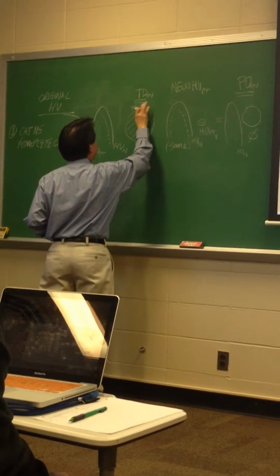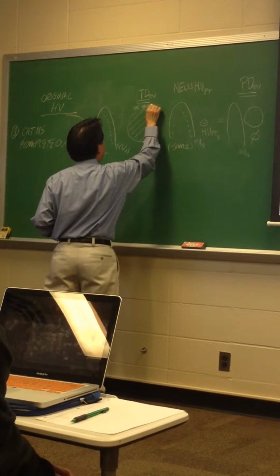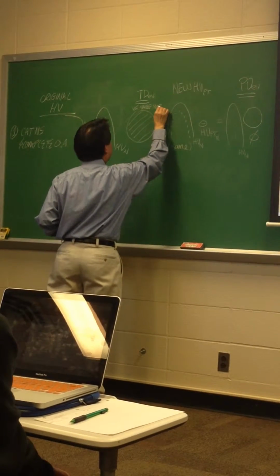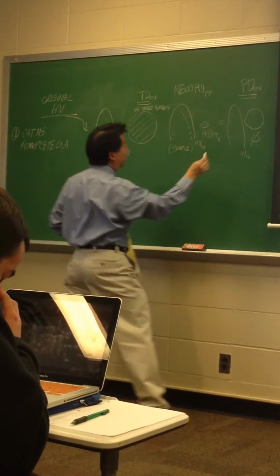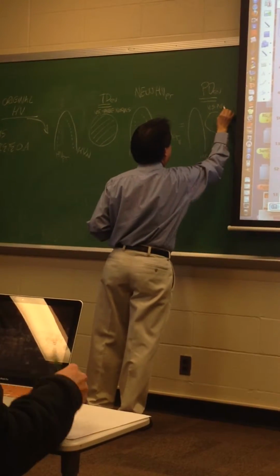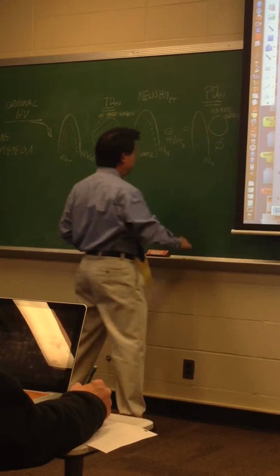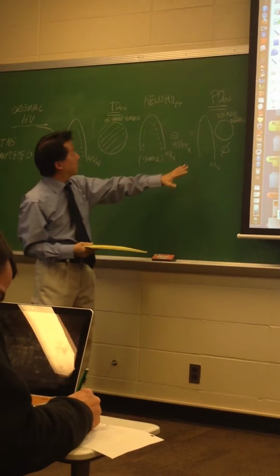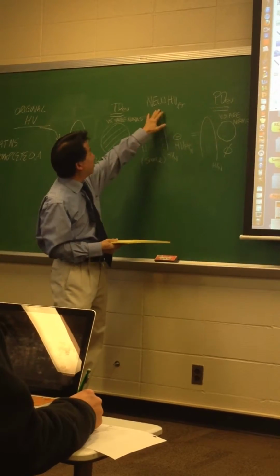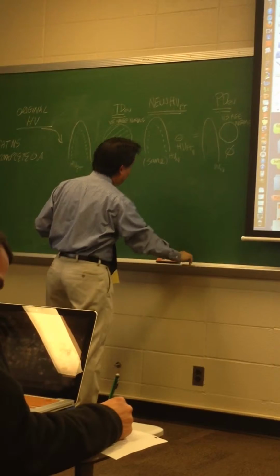Versus norms, age-matched norms. And then the same thing would happen here. See, pattern deviation does this same step, it just has this one step in between. It calculates a new patient mean.